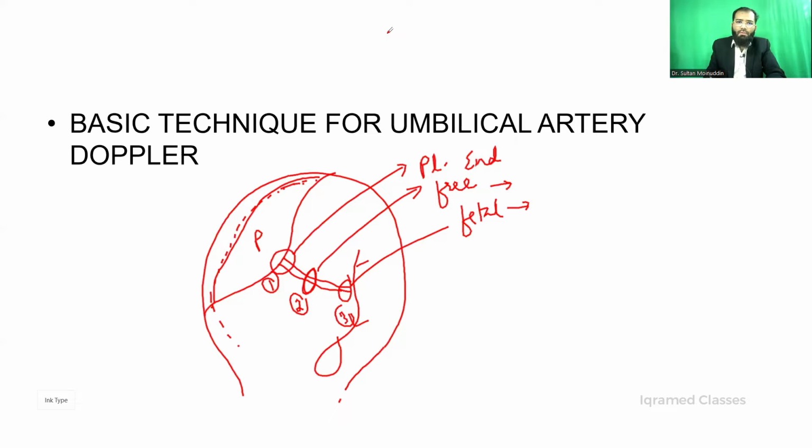So yes, I've got a few of the answers at the placenta. So Farheen has said placental end. Some of you are saying fetal end. Okay. So the correct answer to this is you start seeing changes earlier at the placental end. Okay, placental end. Good. So most of you are going correctly. Yes, you see the changes at placental end, correct?